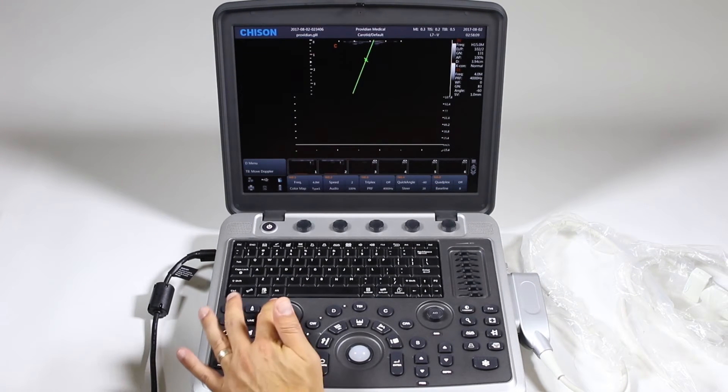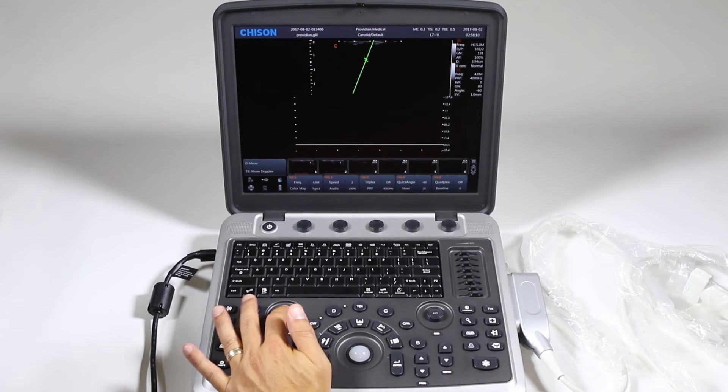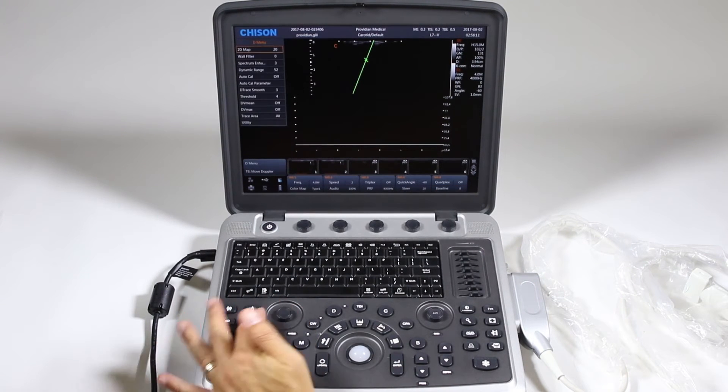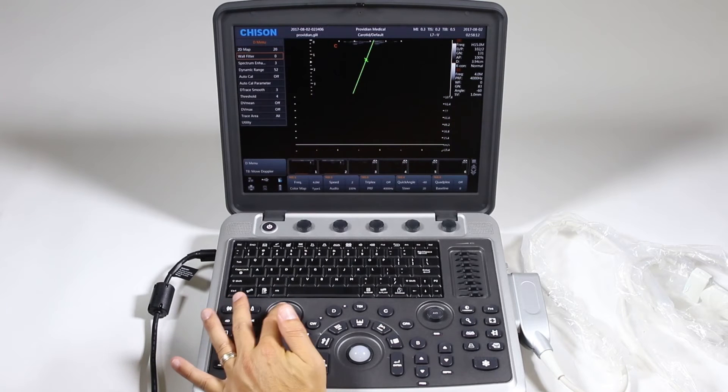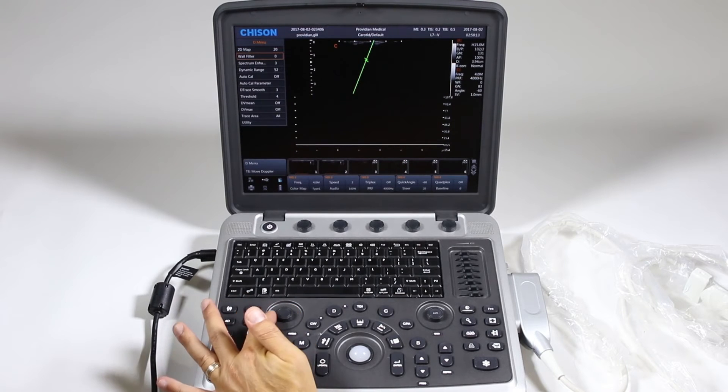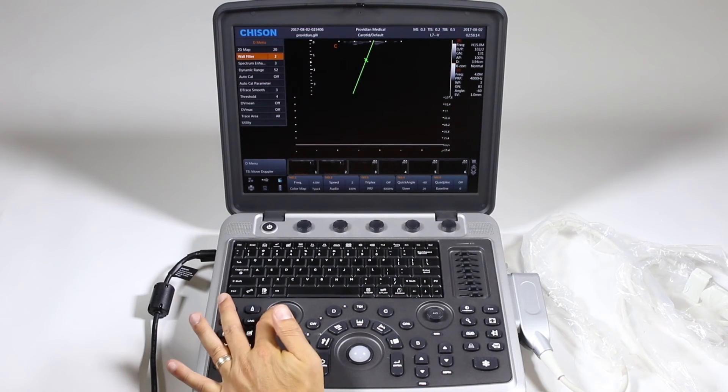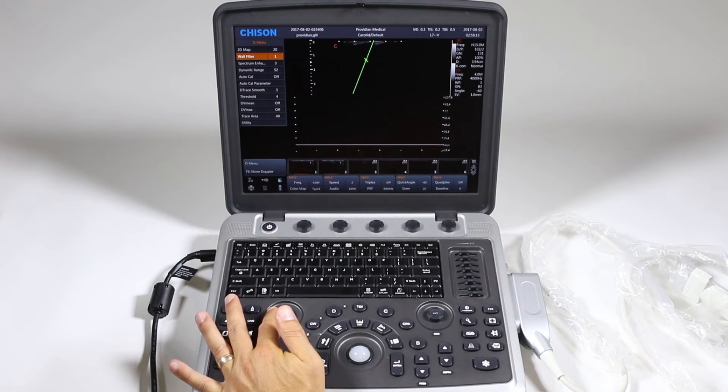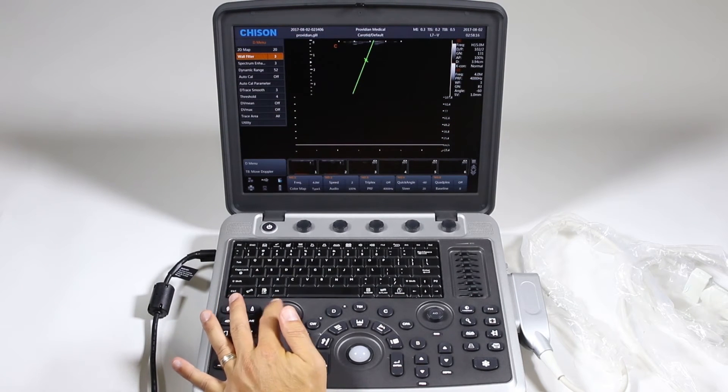So where is the wall filter? Come on up here and push the menu button down. Here you can scroll down, click and adjust your wall filter.